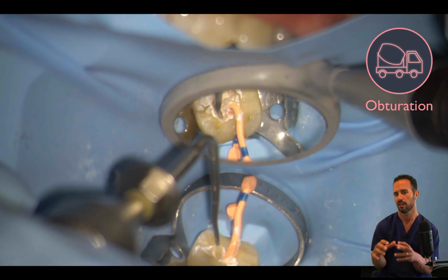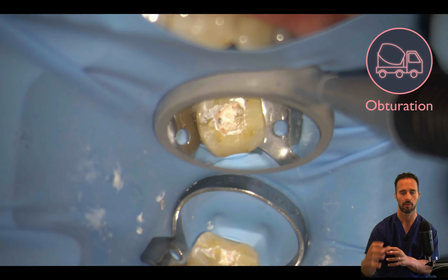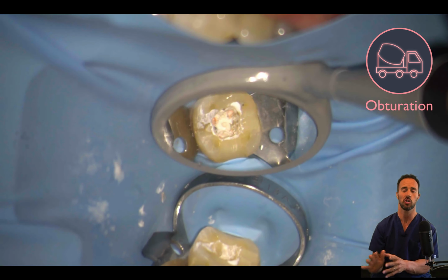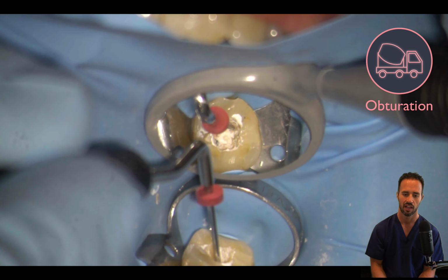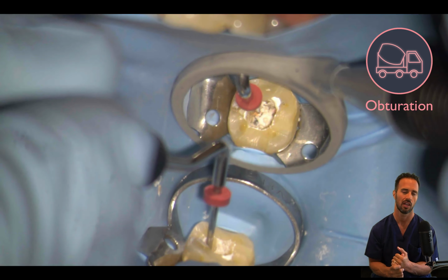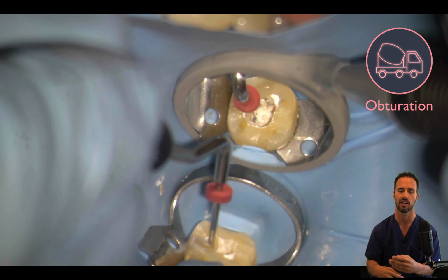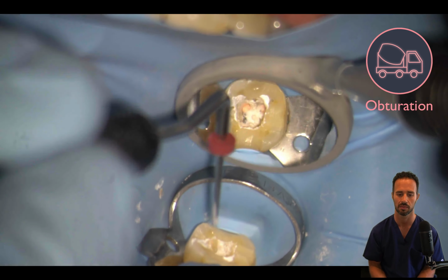So when you first start in dental school, perhaps, you're taught to obturate one canal at a time. That is so time inefficient, okay? Just learn how to obturate multiple canals at once so that you can be very time efficient and your patient is not unnecessarily in your chair for longer than they need to be.